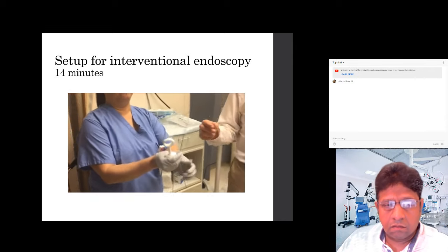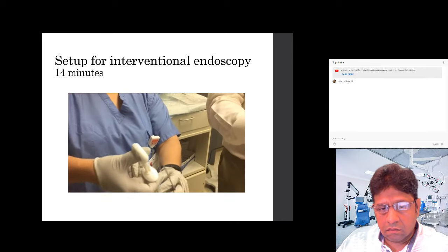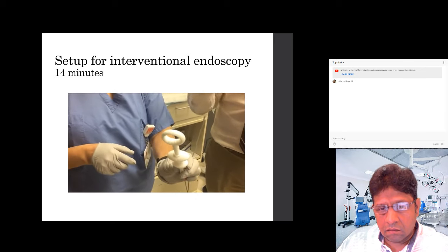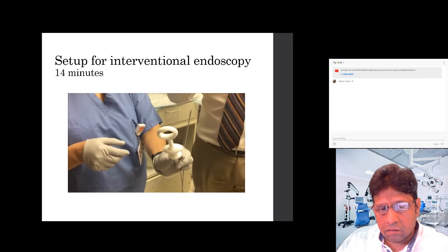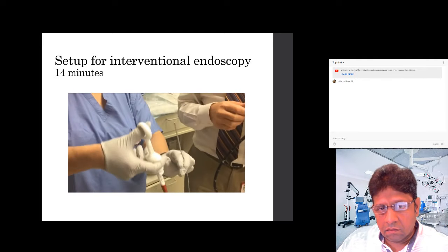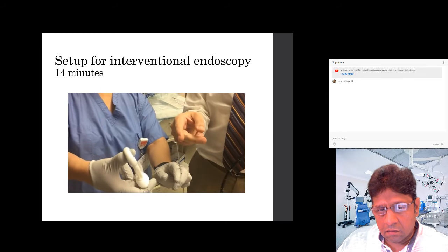Okay. And a clip, well, why don't we show them how to work it before we put it in. So you don't want to squeeze it shut, right? If you squeeze it hard, you're going to deploy the clip. Once you deploy the clip, it's done. It's going to be shot, and you can't do it again. So all you need is to make sure that it's not open. But you can gently open and close, and you can see how it opens and closes.